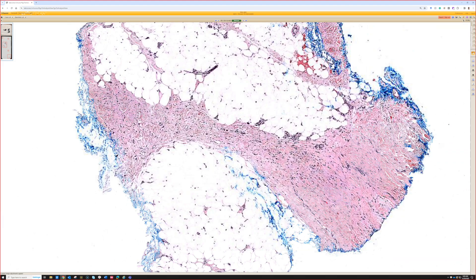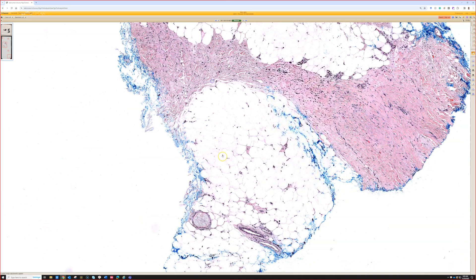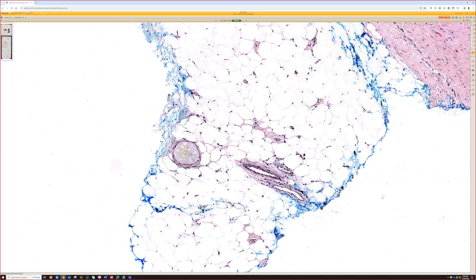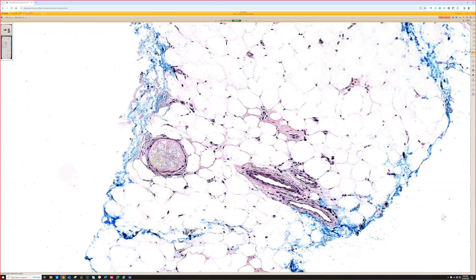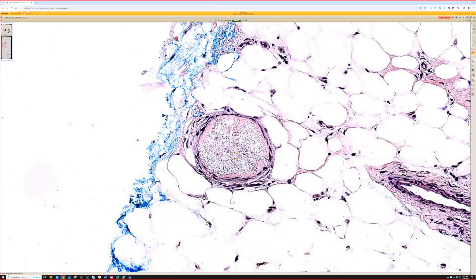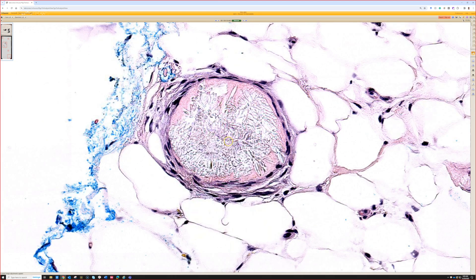There's definitely fibrosis and sclerosis of the fibroseptal in between the fat lobules. But otherwise, it's hard to know why that's happening until we find... then we see this one blood vessel in the deep fat, which has like these needle-shaped crystals.